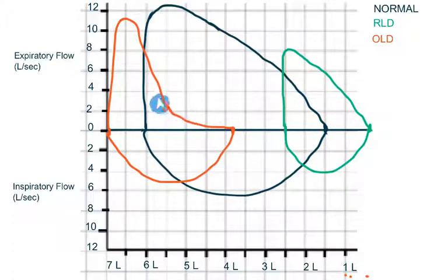This concavity in the curve is because during expiration, the already obstructed airways become narrower and narrower over time until they collapse and are unable to throw out more air. It increases with the severity of obstruction.